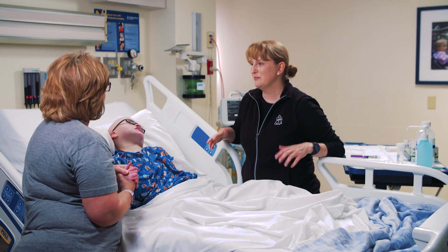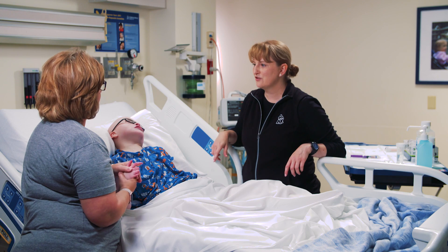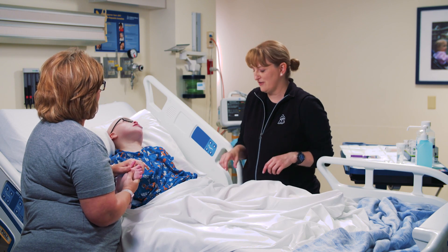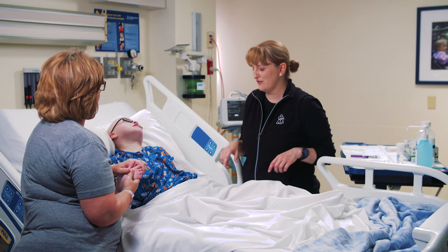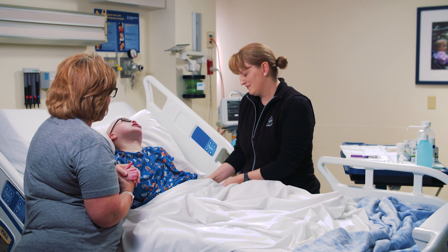So I brought in your new meds. We've already scanned it in on the computer. Could you confirm Ethan's name and date of birth? Ethan, 3304. Next, perform hand hygiene. Verify that the feeding tube, or in this case the extension set, is NFIT compatible and the tubing is properly in place.